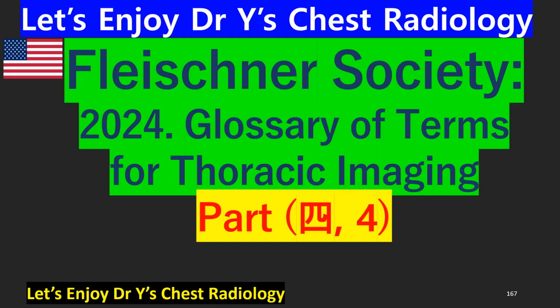Hello, my friends. Nice to see you again. Let's enjoy Dr. Y's chest radiology. I'm Dr. Y, medical professor, chest radiologist, Seoul, Korea. Today we're gonna talk about the part 4 of the Fleischner Society 2024 glossary of terms for thoracic imaging. Let's go.